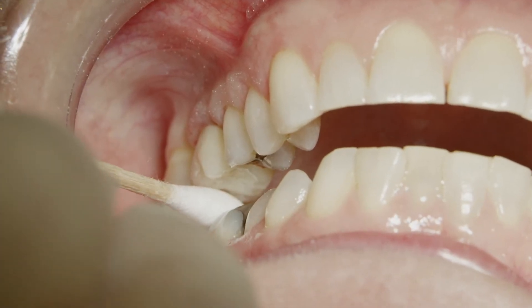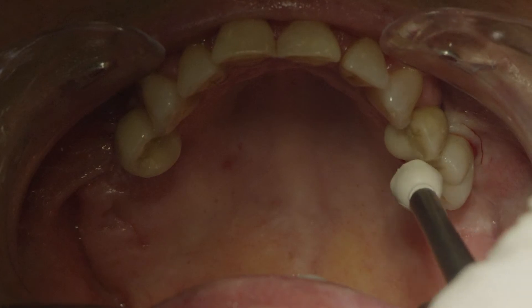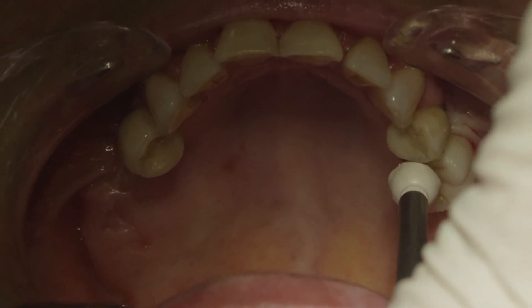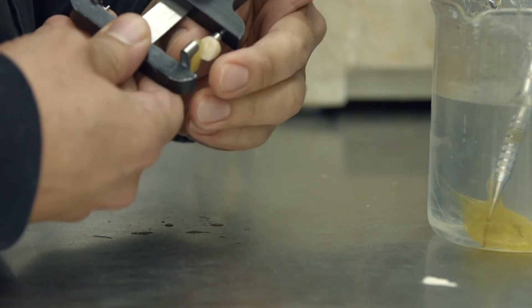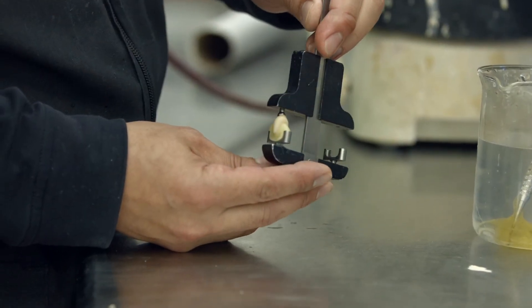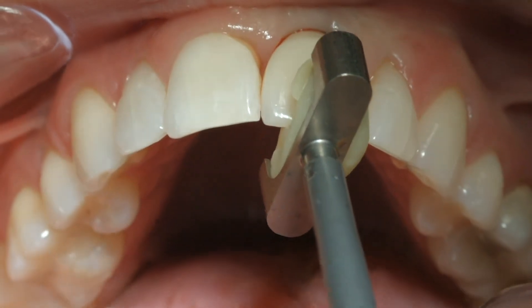After adjusting the contacts, tap the crown in place. For posterior restorations with a mesial and distal tooth adjacent to it, the patient can just bite down on a cotton swab and the crown will be seated. Alternatively, they can be tapped using the straight or offset handle instrument connected to a plastic healing abutment or with a small piece of a wood tongue depressor. For maxillary anterior restorations, a jig must be made by the lab or by the clinician in order to tap the crown on the long axis of the abutment shaft. More about the jig fabrication can be seen on the Bicon website, where there are detailed instructions about it.